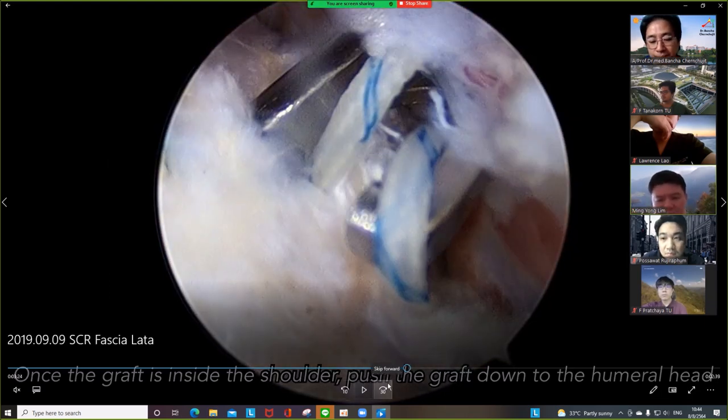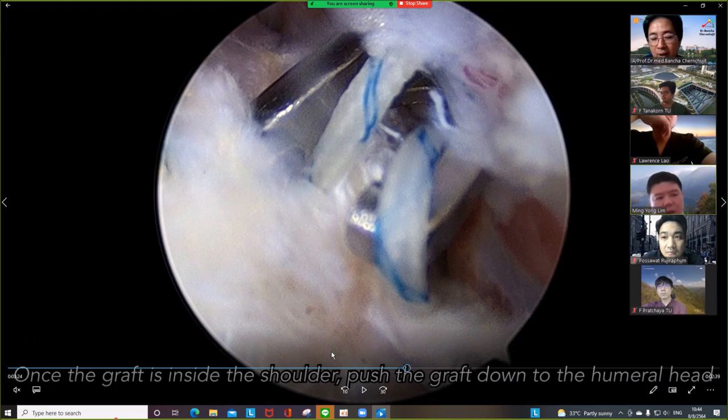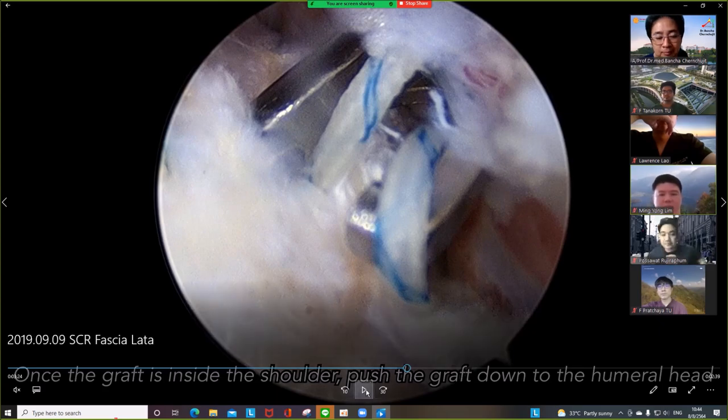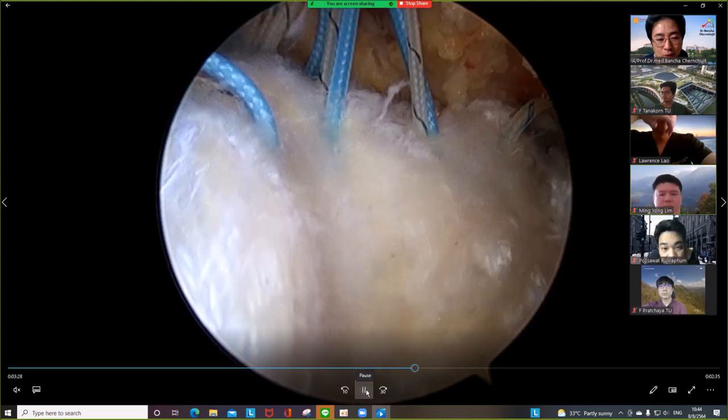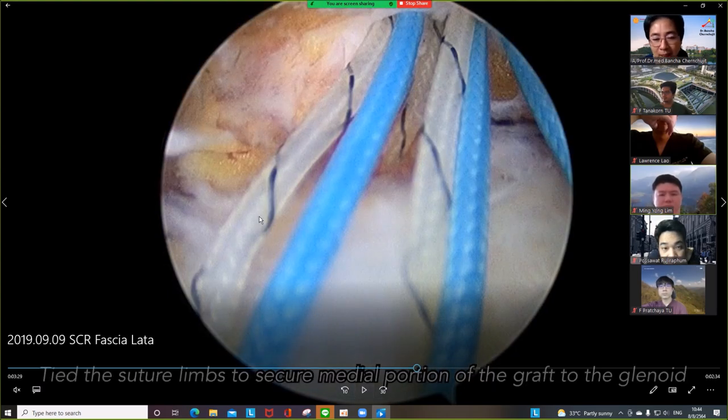The Neviaser portal is to retrieve only the medial suture — you pull in one direction. Keep the lateral suture outside. Only pull the medial suture because you want to pull in one direction; keep the lateral suture outside. Then I retrieve the suture one by one — make it in order.